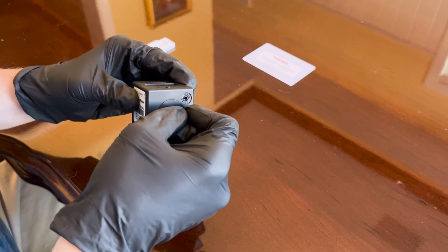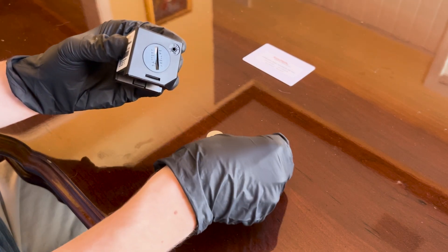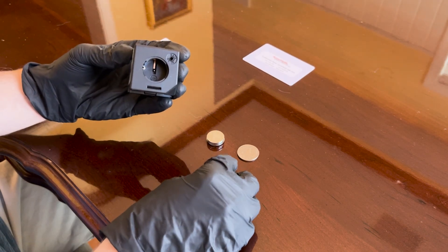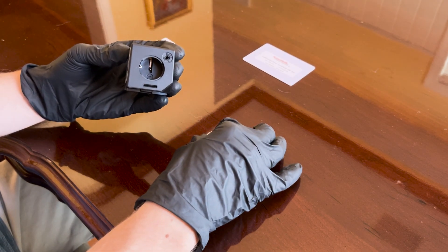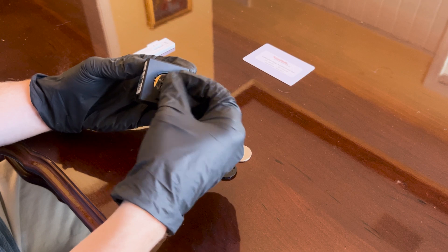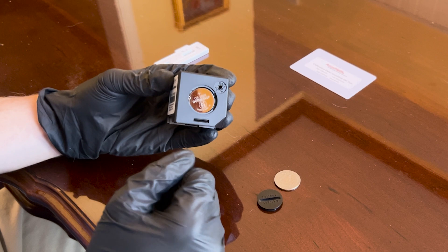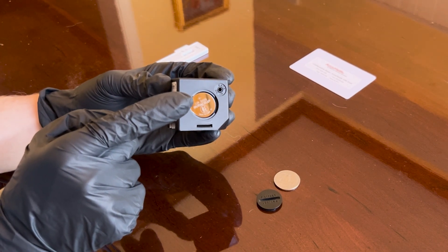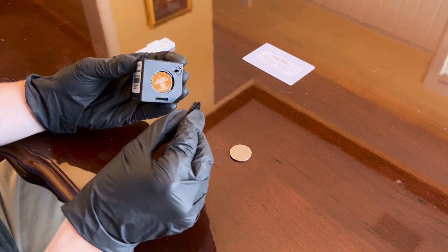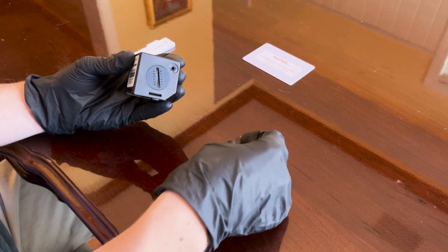Turn the battery cover counterclockwise until it stops, remove the cover and set it aside. Now I'm going to insert the three lithium batteries into the battery compartment, noting the correct positive and negative signs. I'm inserting each battery and making sure that the plus sign — the positive end — is facing outwards. When all three batteries are inside, return the battery cover and close it in a clockwise direction until it stops.